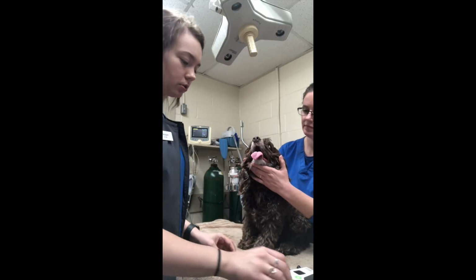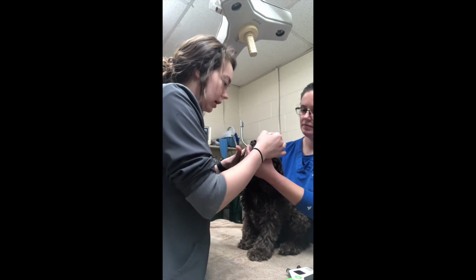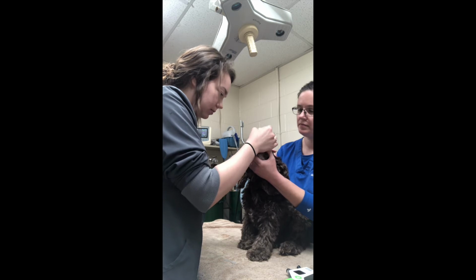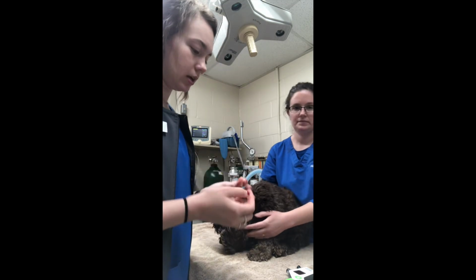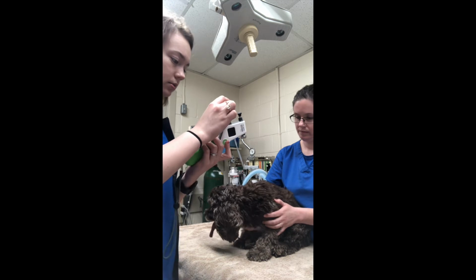Okay, now we're going to do the tonometry. I'm going to start by applying topical anesthetic. We have a tetracaine, so we're going to apply 1 drop to each eye. And while that's setting in, I'm going to get my sterile tip to put into the handpiece.